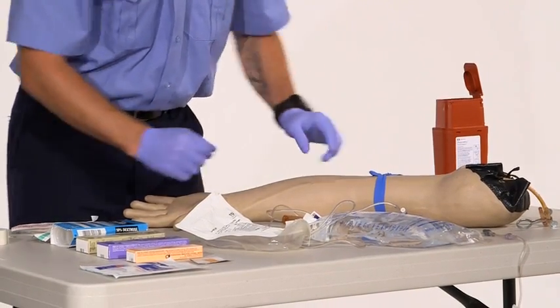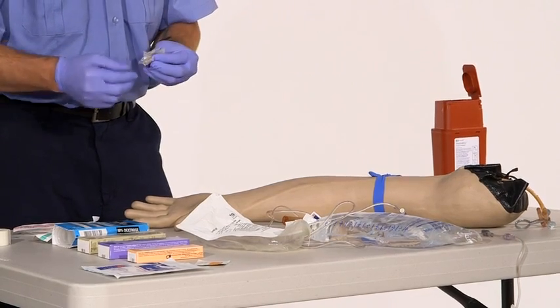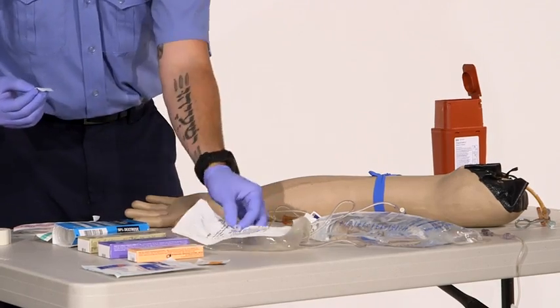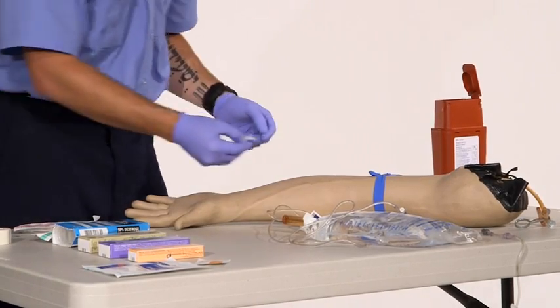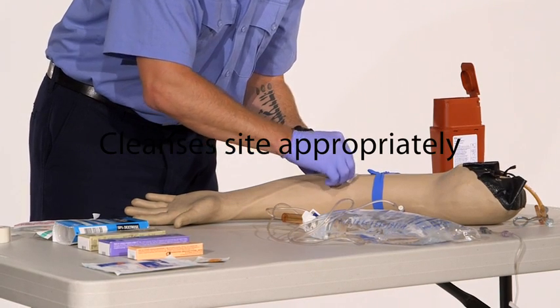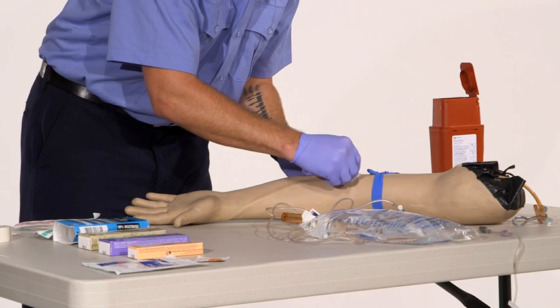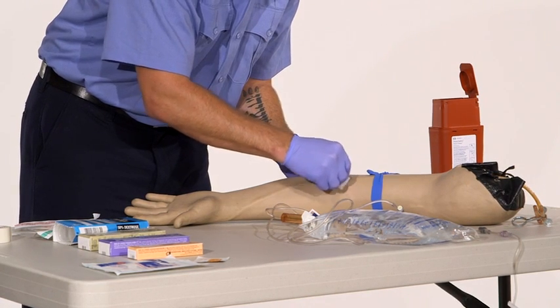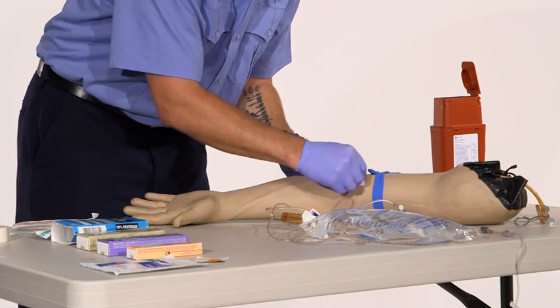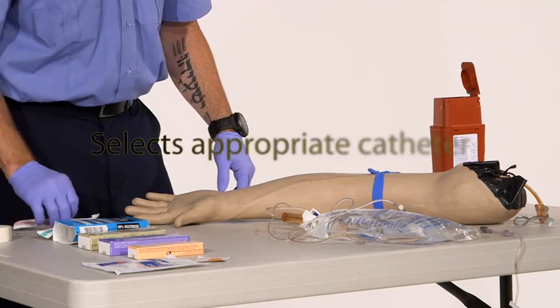All right, got a good vein there. Use a prep pad to clean the site. All right, got the site clean.